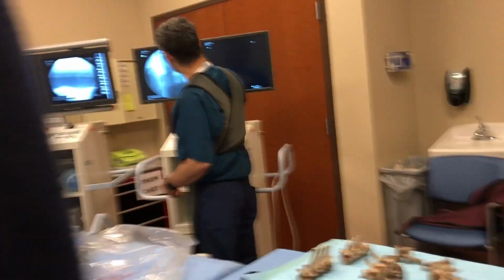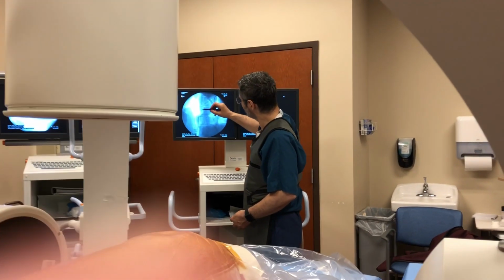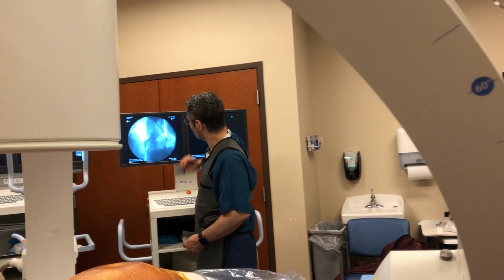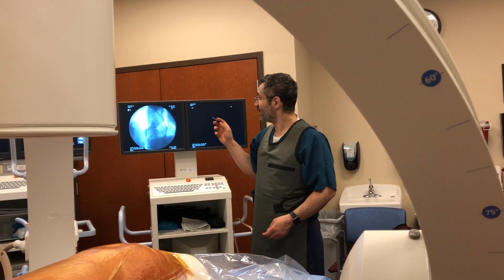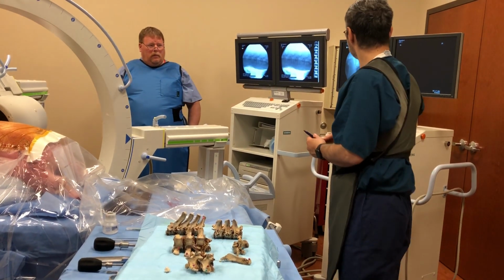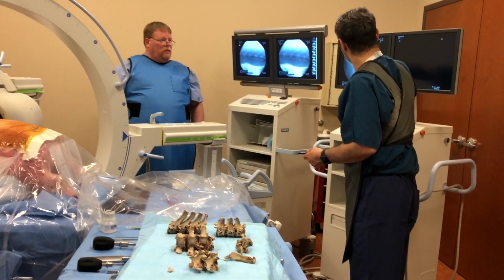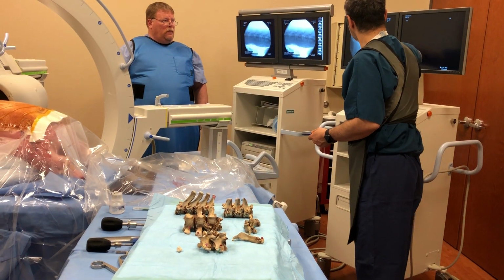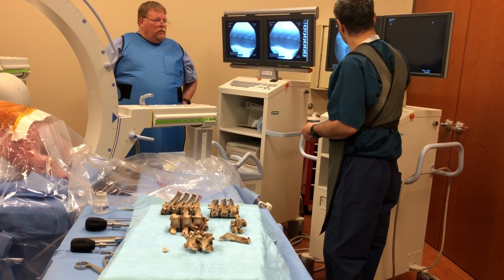The pedicles are huge in pig. As a matter of fact, these are the borders of the pedicle. We would be lucky if in our patient we had a pedicle that size. But this makes a perfect case for doing pedicle screw training on a student and a resident, because once you get used to putting in a big pedicle like that, you can adjust your approach and so on. But the characteristics are the same, obviously.